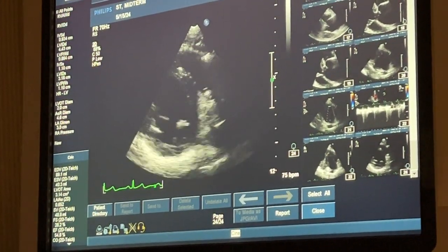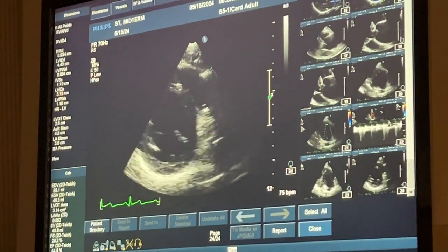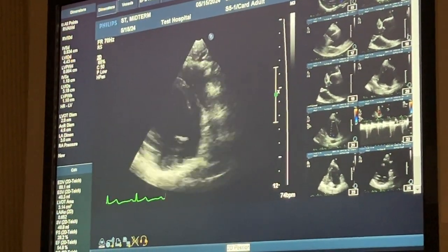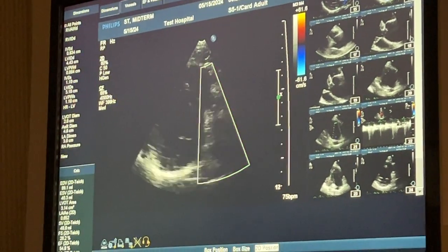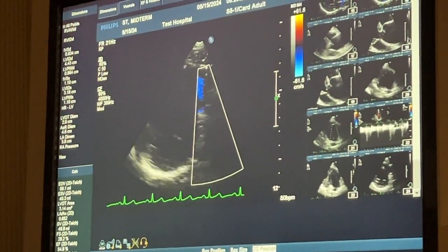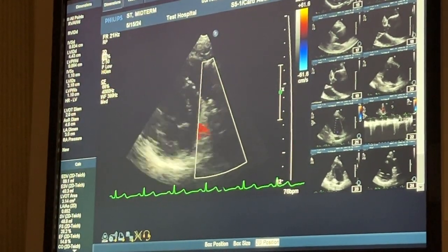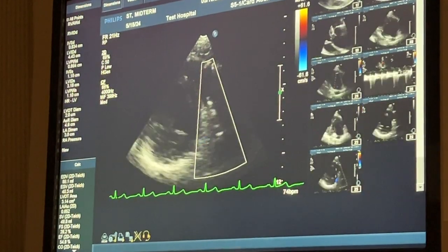Okay, that's what I was going for because I knew that there was something in there. But let's go back. How do I get out? All right. So now I'll use color. Okay, do the same thing. Little breath in, then out. Okay, and hold it out right there for just a second. Okay, breathe normally.